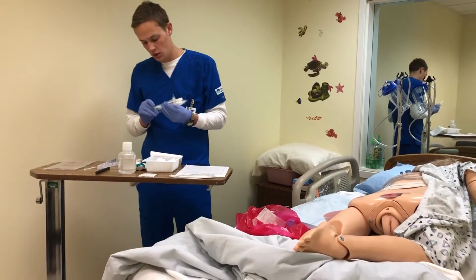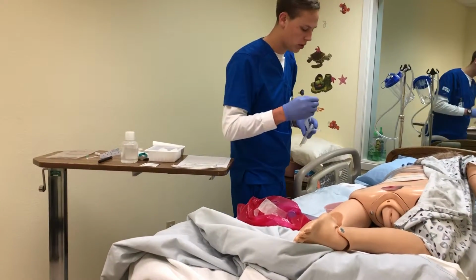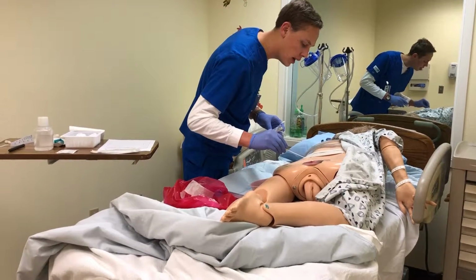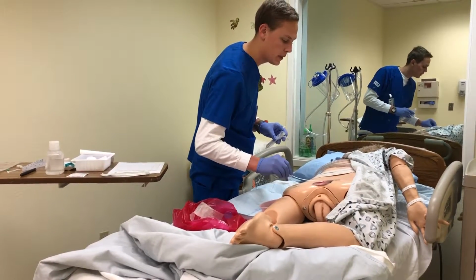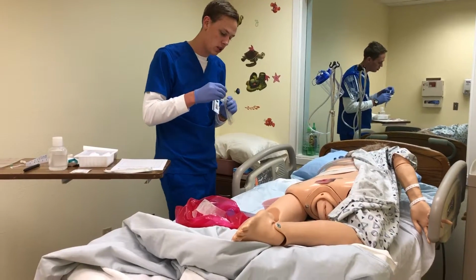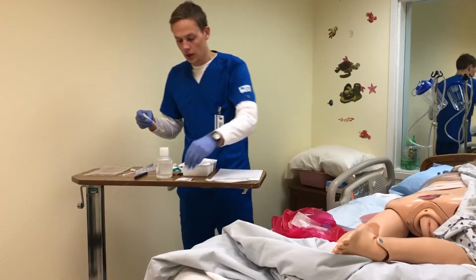Okay. And I want to make sure that this one's open and ready. And then I'm just going to pull this one out. And I'm just going to put it right on the granulated red area and push and get force so that I can get return from it. I want to stay away from any eschar or slough. Make sure it's evenly coated, and then when I insert it, make sure not to touch one of the edges and seal it. That can go into the garbage.